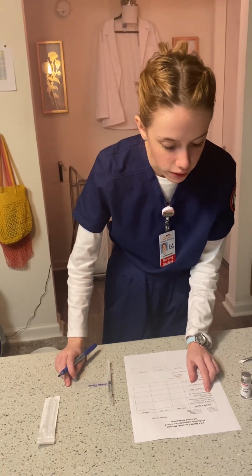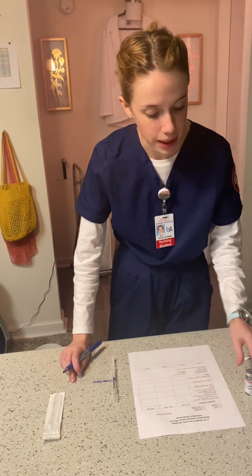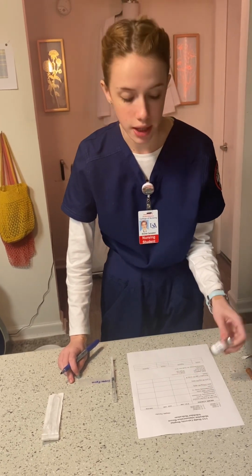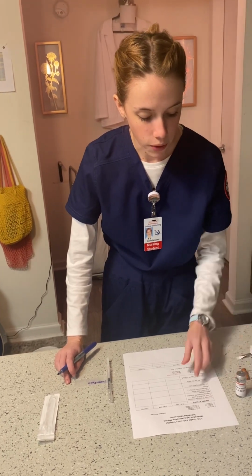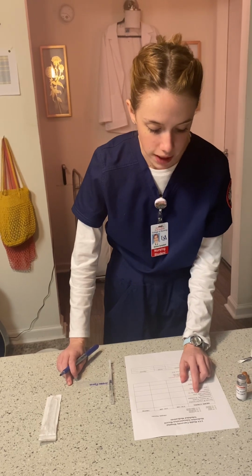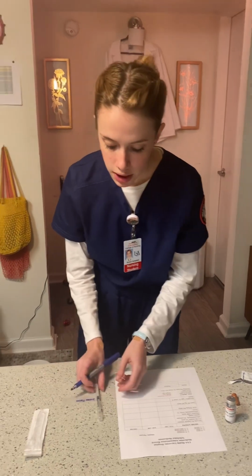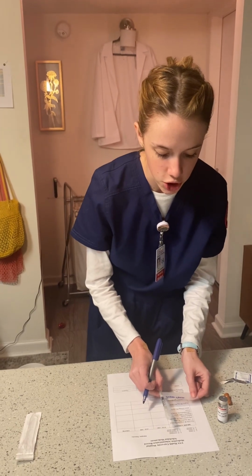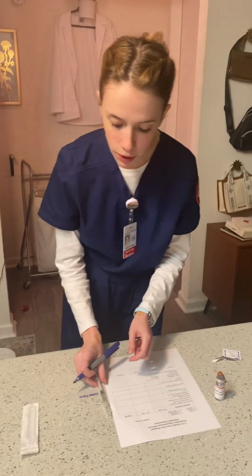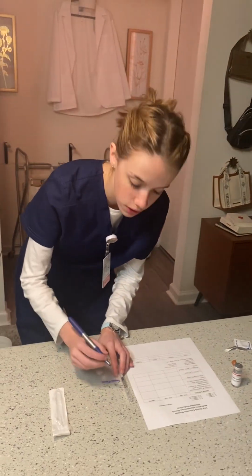Next, we are going to verify the right medication. So we've got heparin ordered for the patient, and we have our heparin vial right here. I'm going to compare that with the MAR. Next, we're going to verify our right dose, which is 5,000 units, which will be 0.5 milliliters as we previously calculated. So I'm going to go ahead and hold the syringe up to the MAR to verify the volume in the syringe. And we're going to go ahead and write the medication as well as the correct dose onto the label.